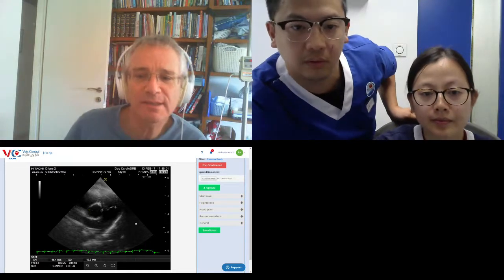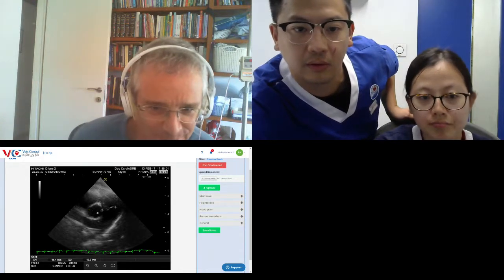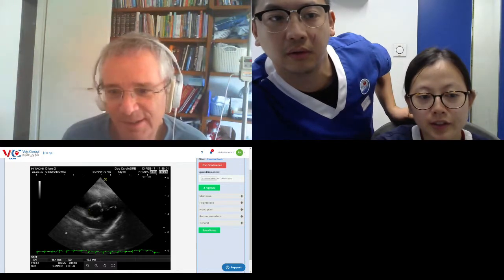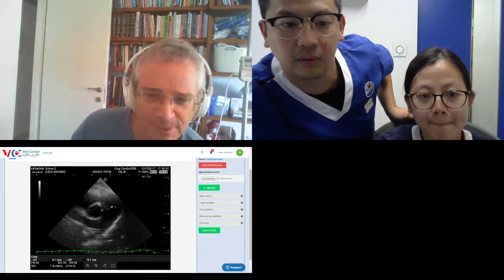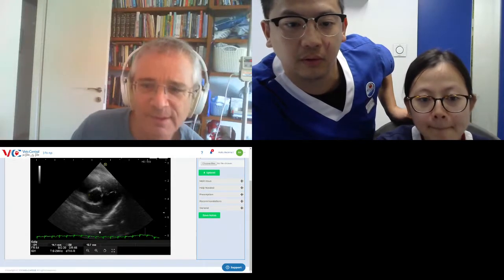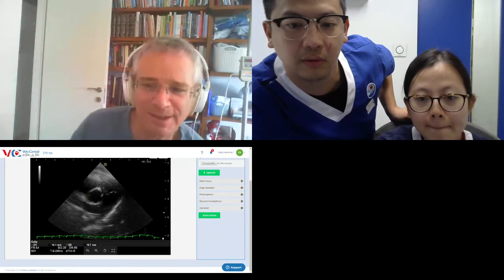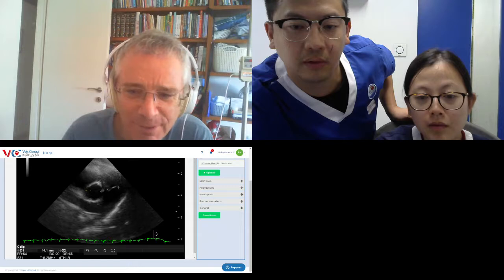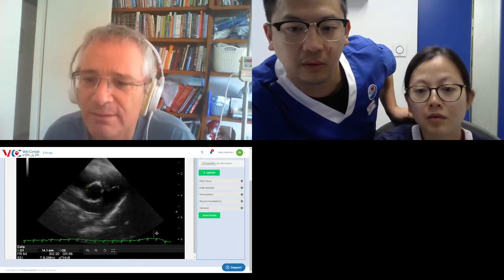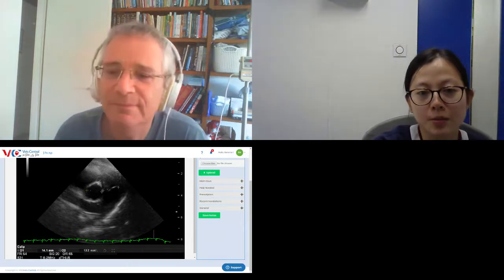Do you know by the ECG whether this was frozen in peak systole or not, or is this too hard a question? No idea. Okay, is the white line at the bottom a time bar, or is it just coincidence? If you go to the right, and stop, go 2 beats to the left. You see that white upright line? Is that a time bar, or does it have nothing to do with the ECG? I think it's a time bar.